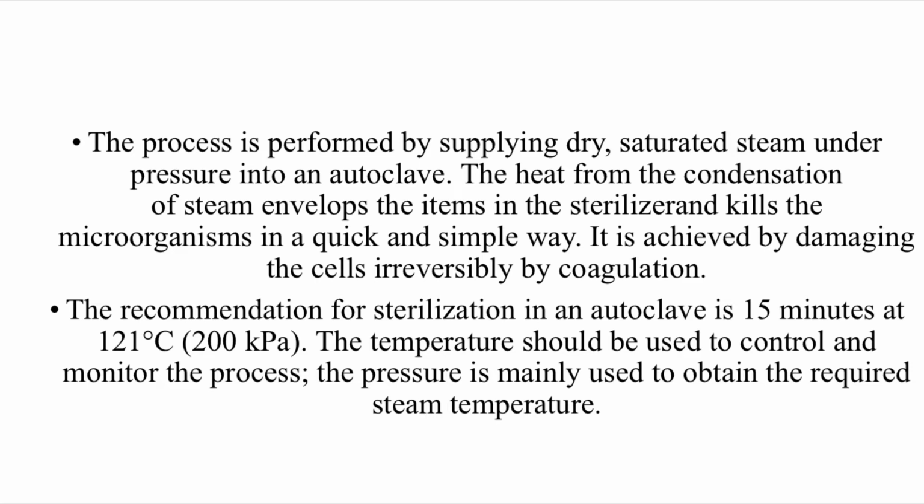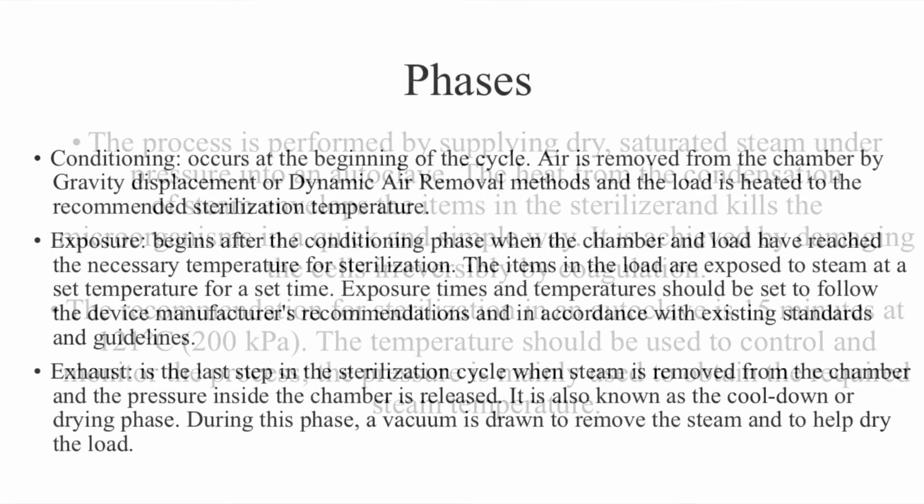The recommendation for sterilization in an autoclave is 15 minutes at 121 Celsius. The temperature should be used to control and monitor the process. The pressure is mainly used to obtain the required steam temperature.